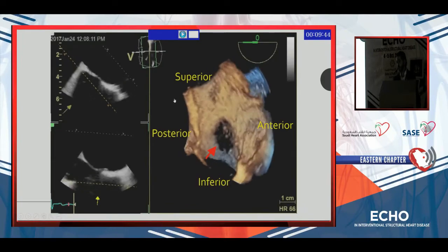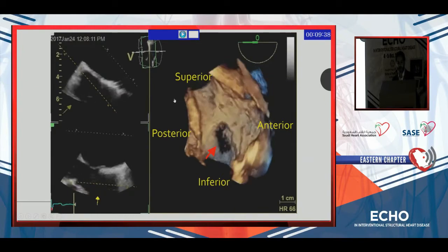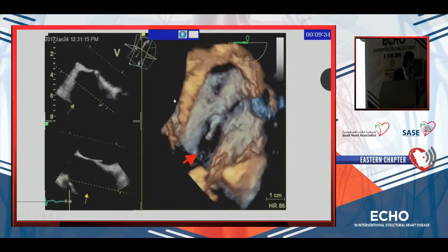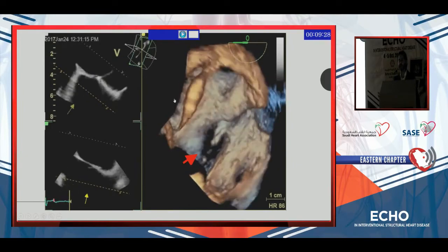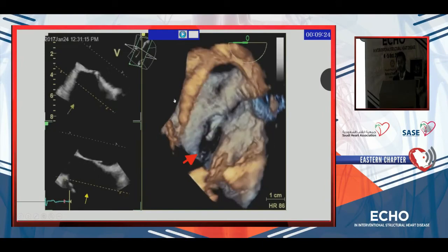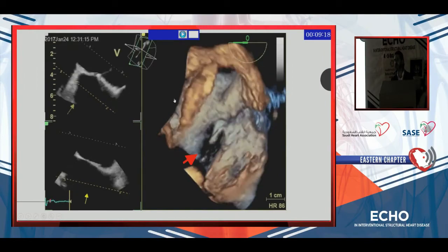The easiest way to do 3D. If you do a 3D and you know where the best place for puncture is, where the red arrow is, you will guide the operator here. Sorry. Sometimes the wire will slip into the PFO, and then you maybe want the operator to withdraw it and try to puncture the septum in the correct position if he wants an easy procedure.